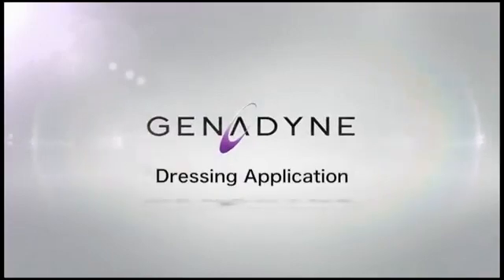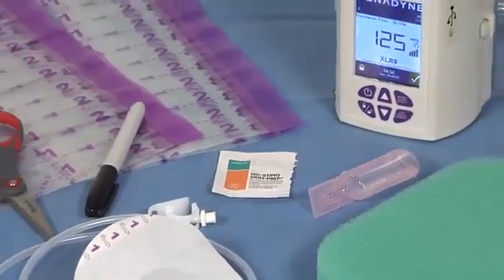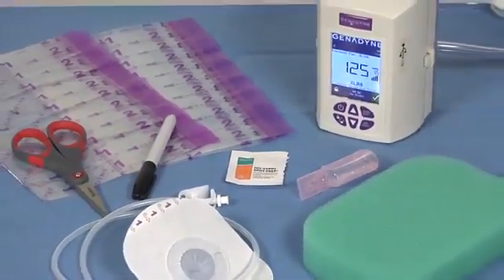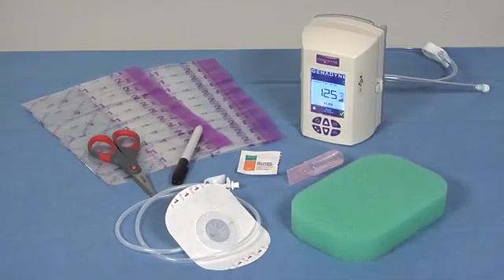Dressing application. Before starting negative pressure therapy, confirm the physician's order and assemble the needed supplies. This includes the dressing kit, the negative pressure wound pump, and the collection canister.